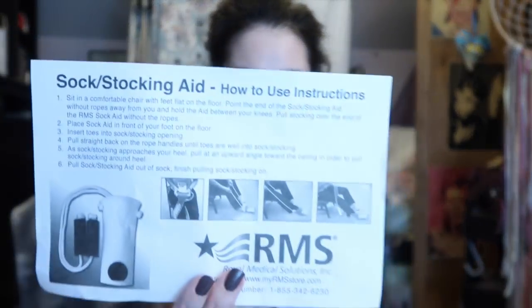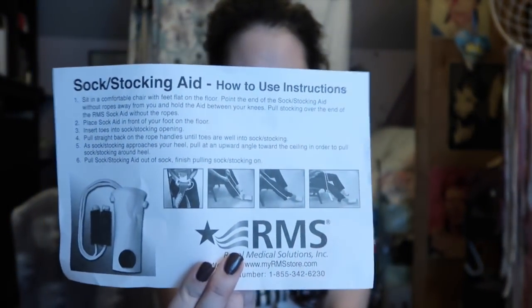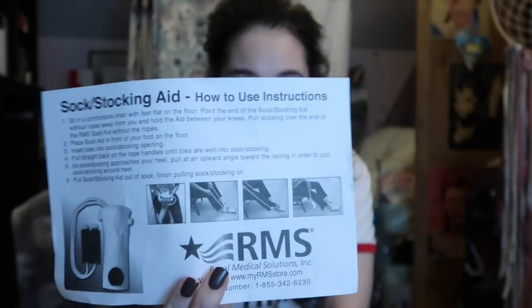This is all they gave me for instructions. And I would like to point out that the pictures are printed in black and white and are almost impossible to actually see. Which is a total shame because I know that most of the people using this are probably elderly — there's no way that they can see these pictures if I can't. I know my vision's not great, but it's not that bad. Well, anyway, let's get to the testing part.